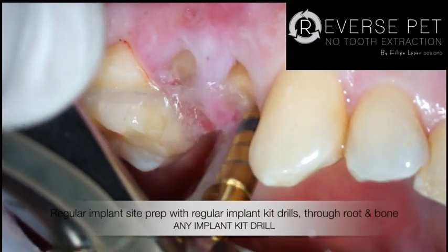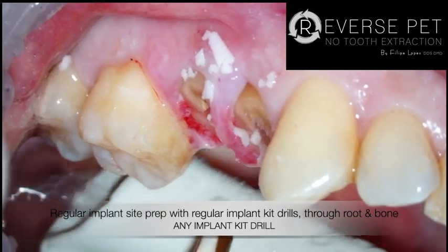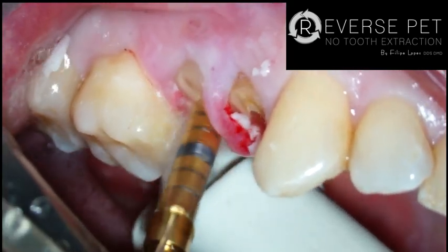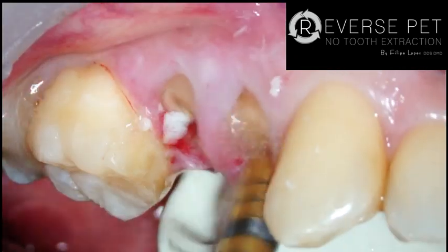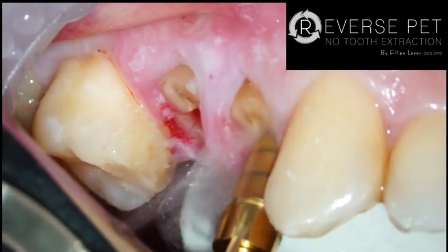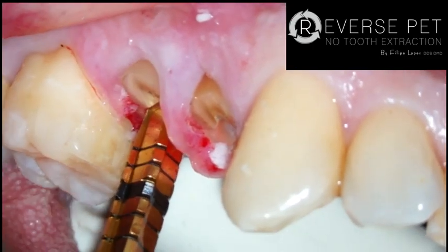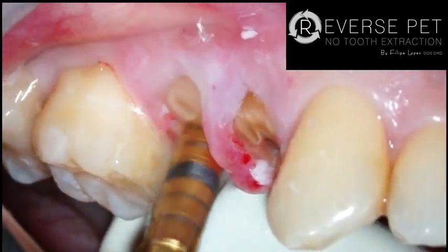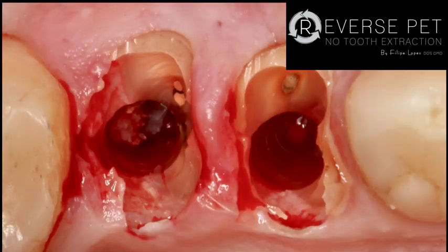As you'll see later, I will stay a little bit shorter on this bur, shorter of the diameter that I want. But I am preparing almost everything, and as you can see, most of the time you can do it very easily. Of course, this is a little bit harsher on your burs, but the advantage that you get from having the tooth support to prepare the site is absolutely awesome. So you end up with this beautiful picture.